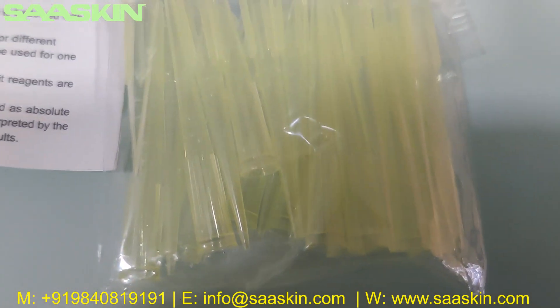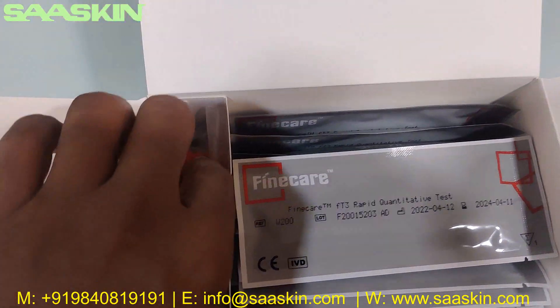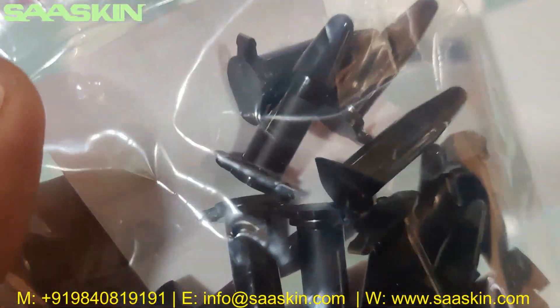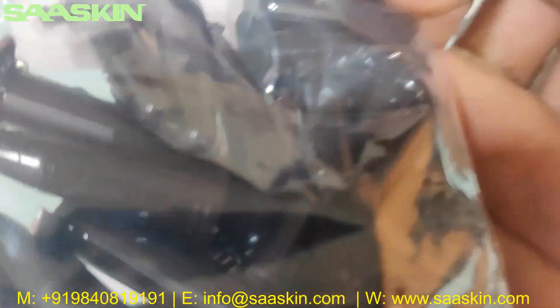You can see the 25 pipette tips here. And you can also see the 25 detection buffer liquids — they are a black-colored liquid.